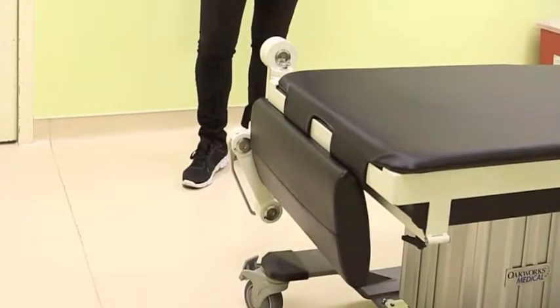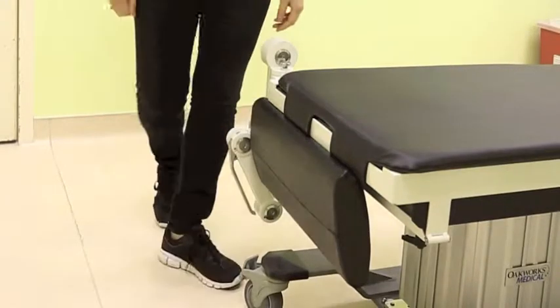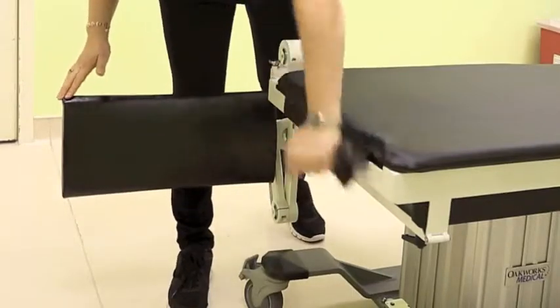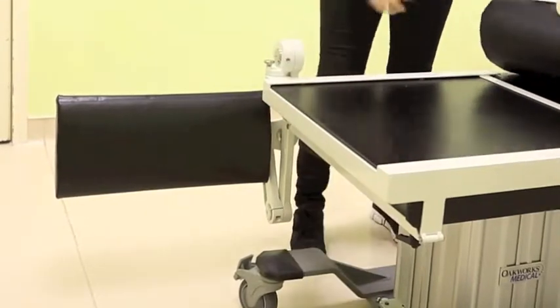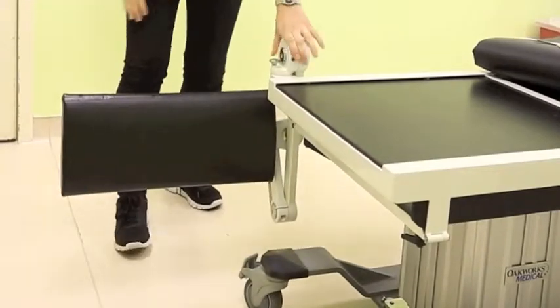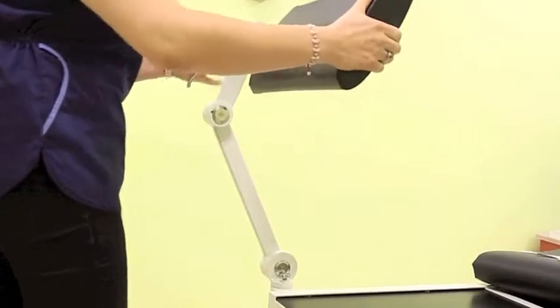This is FluorArm. FluorArm is a device that allows you to inject in a sitting position, and this is how it works. Basically it has two pieces: the first one is the frame that is attachable to any fluoro table, and the second one is the actual arm that gives you the freedom to adjust it anywhere you want.